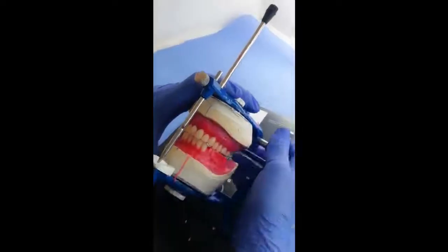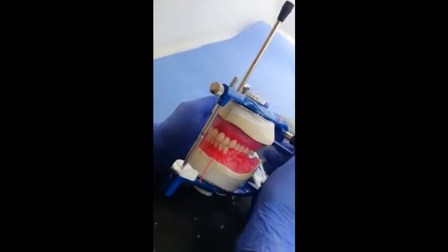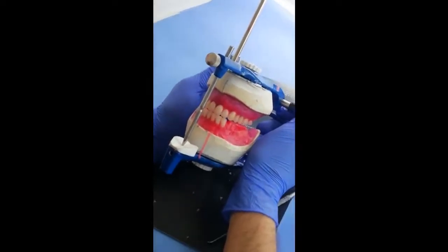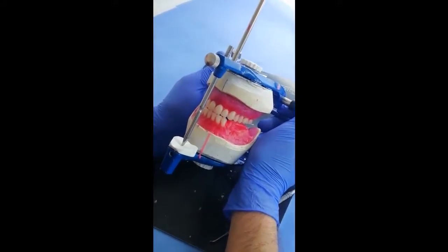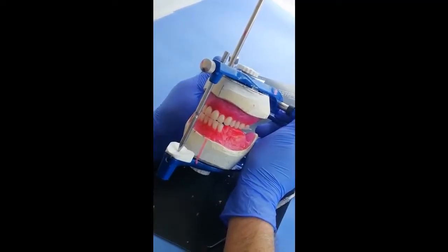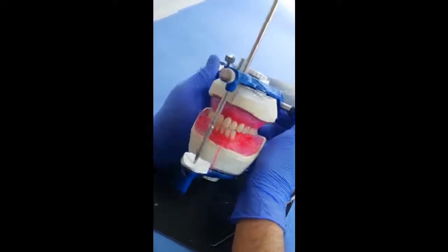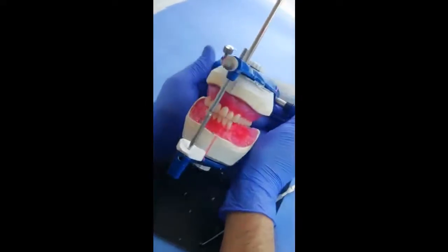Now we check the protrusive movements. As we said, we open the centric locks here and we move the mandible forward. Now you can see that we can achieve edge to edge touch of the anteriors without the separation of the incisal pin. And in lateral excursions, you can see you can achieve tip to tip with the canine and tip to tip with the canine without the separation of the pin.